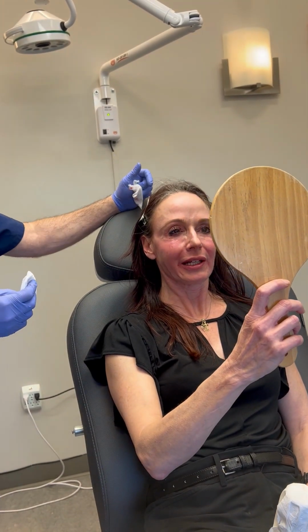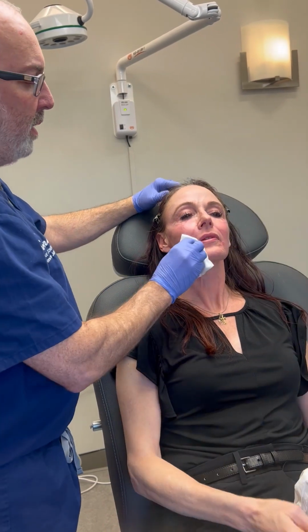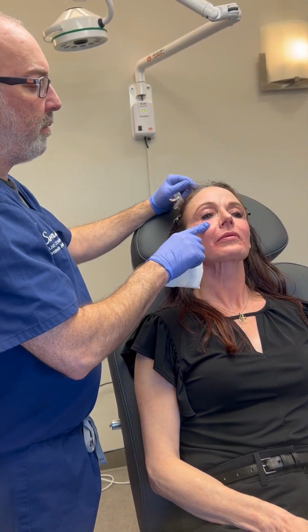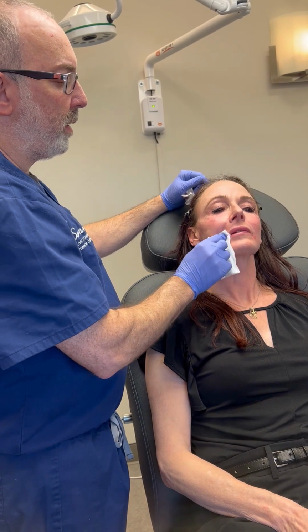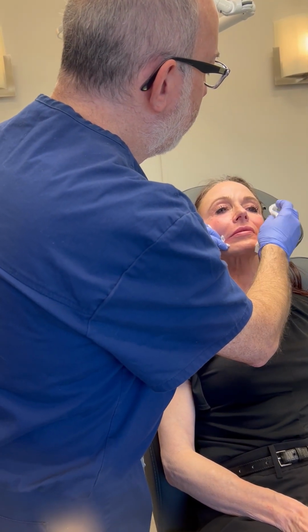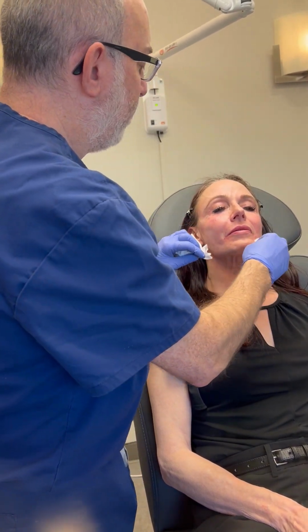Oh, it's pretty. I can't talk. No, it's gorgeous. Yeah, so I think we'll save the other half, just like we're saving the other half of the Restylane for the under eye, which you may or may not need. I don't like to put it in all at once, and often with the lip it's the same thing. Unless someone's really volume depleted, we typically will split that into two.